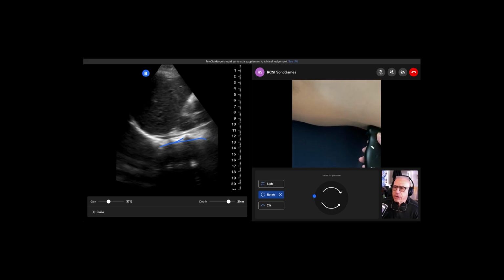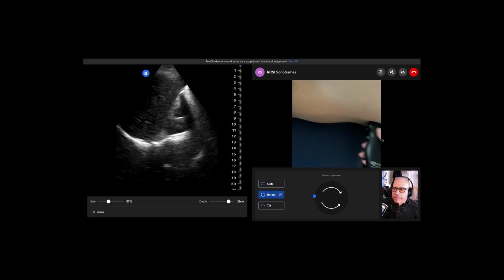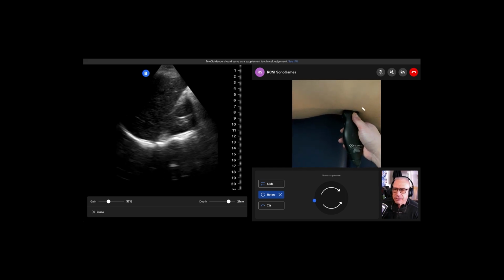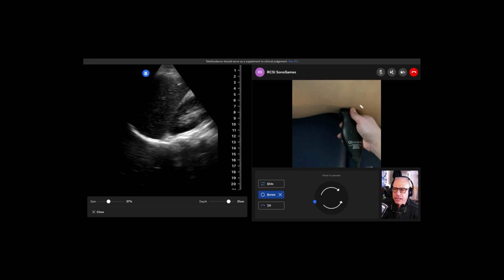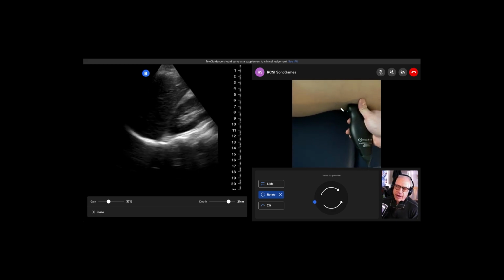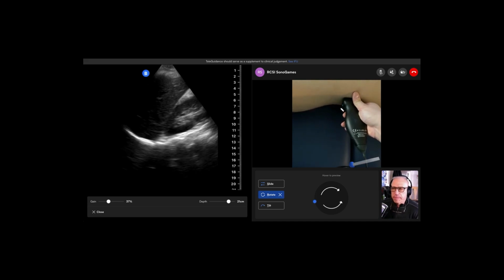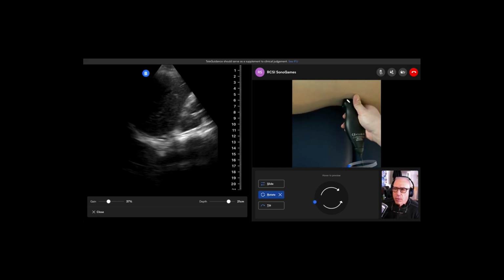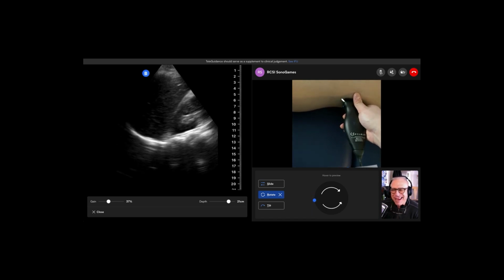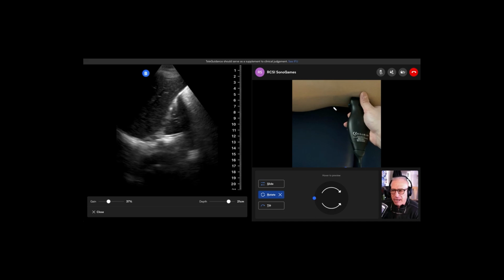One thing, you see how you're holding your hand? You take your hand and actually touch skin. Slide your hand so there's pressure against Greg's chest. Contact. Now you can stabilize that transducer. I will often flip my hand over. You can pick whatever ergonomics you want, but when you're holding a transducer on the side of somebody's body and it's in midair, it's just going to slide. And you're going to say, damn it, I had a great picture.